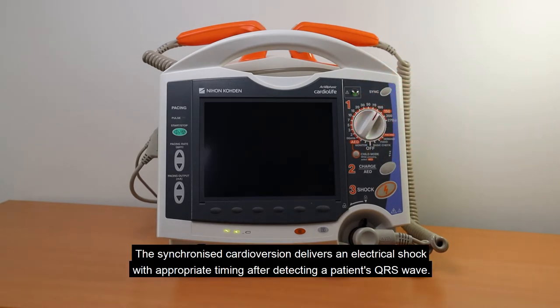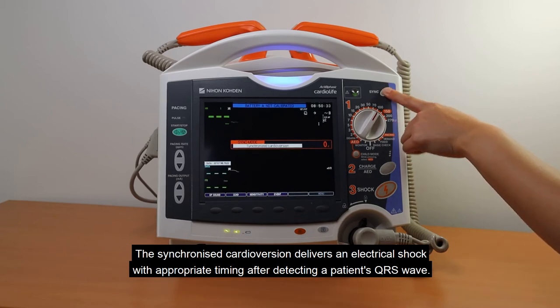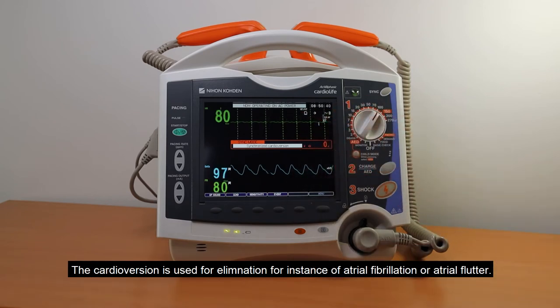The synchronized cardioversion delivers an electrical shock with appropriate timing after detecting a patient's QRS wave. Cardioversion is used for elimination of, for instance, atrial fibrillation or atrial flutter.